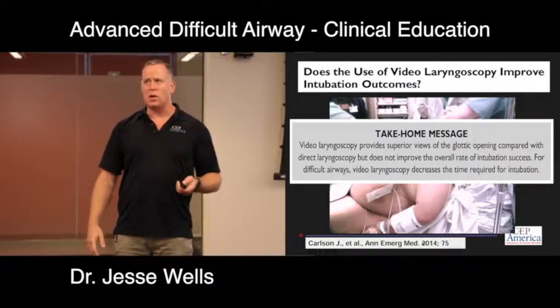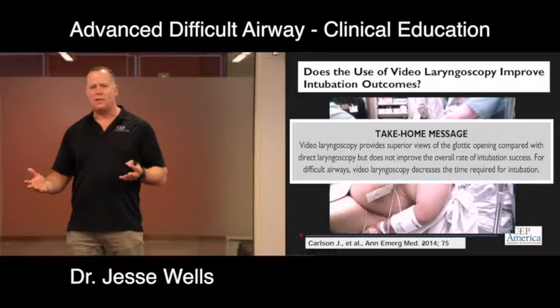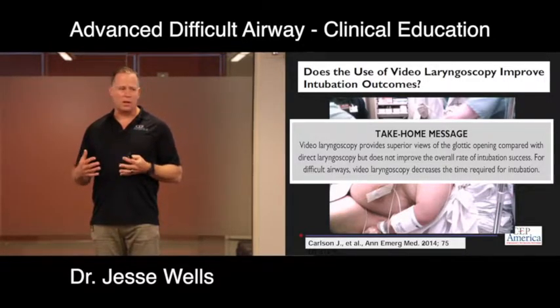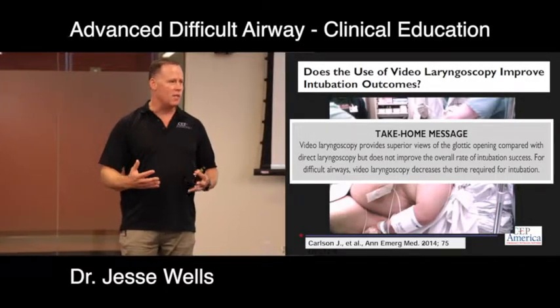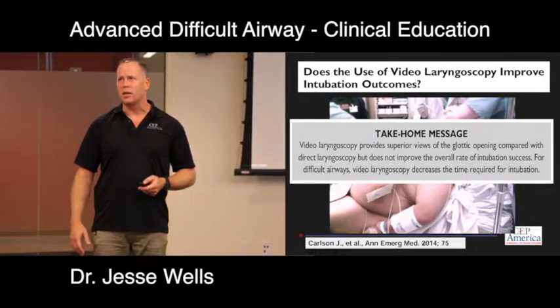And the take-home message was that video laryngoscopy gives you a better view. There's no difference in the rate of intubation success, but it was potentially faster with video laryngoscopy. So does that imply that this anesthesia group that participated in this study was more facile with video and therefore could do it more quickly? Probably. That's probably the difference there.